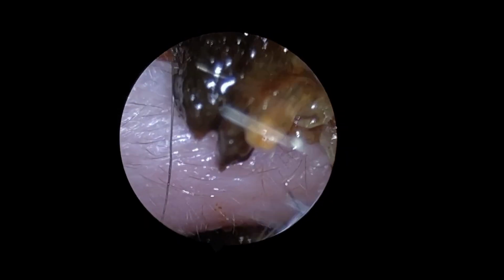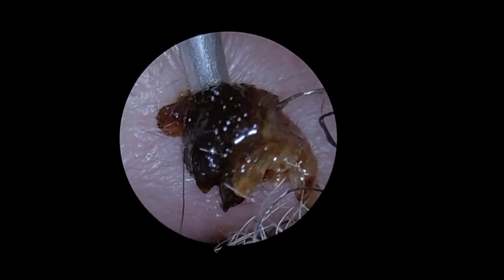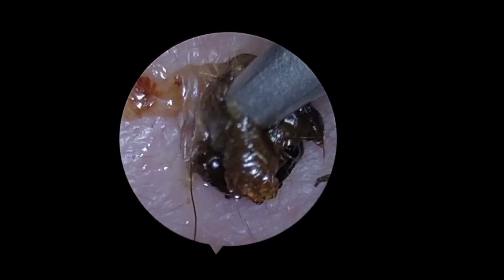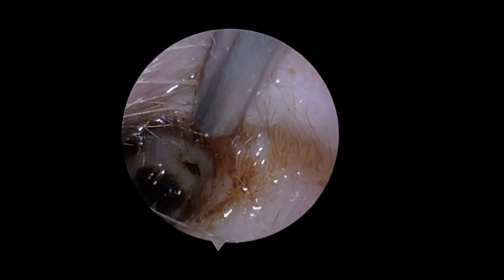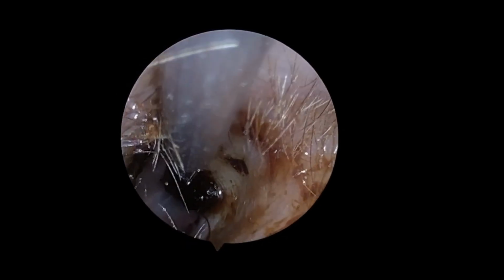And here's a still shot of it together with a thick tragus hair attached here, which is actually embedded in the wax, probably because it's been snipped by the patient and it fell into the ear, getting stuck in the earwax blockage. In to get the remnants which didn't attach to the large extraction, and the first part comes away beautifully.